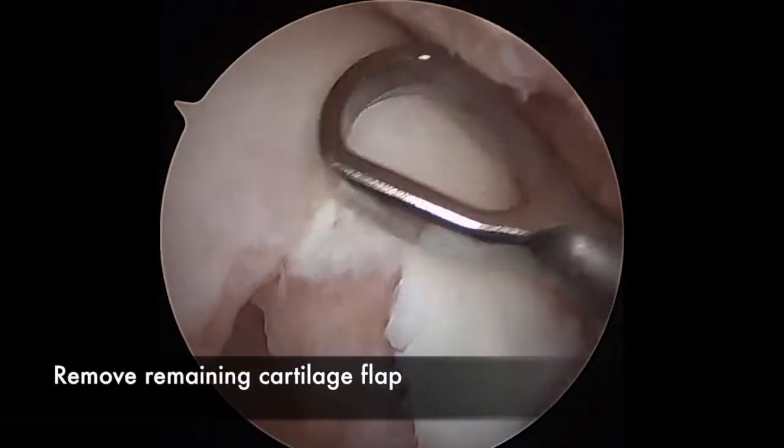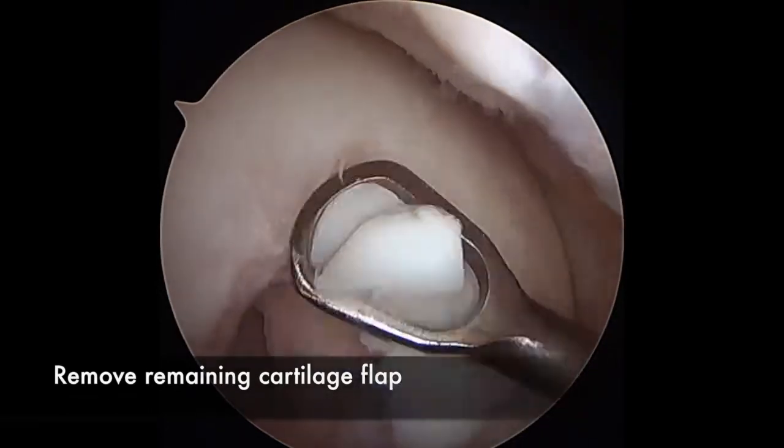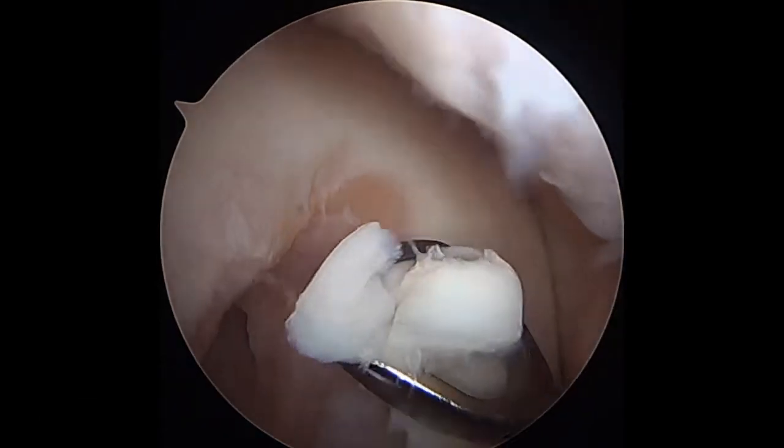A curette is used to remove the remaining flap of cartilage to healthy stable margins.